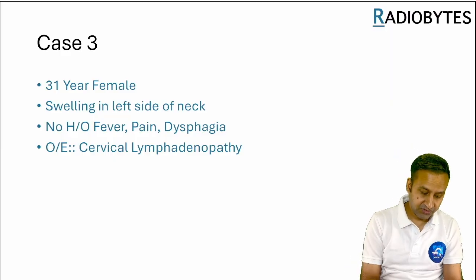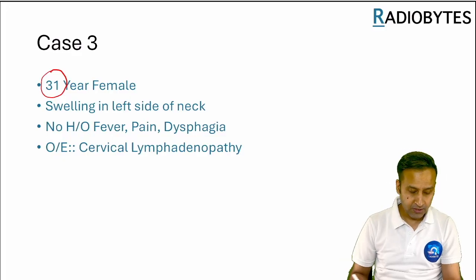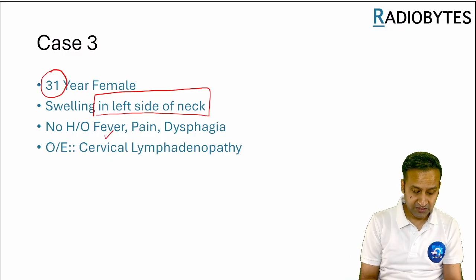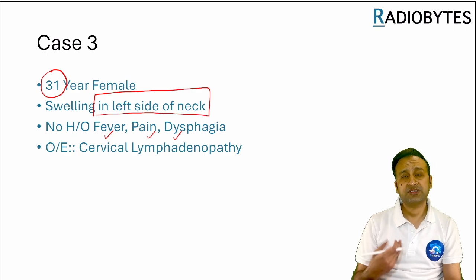Now, this case number 3, again, a young female, just a 31-year-old female, coming to us with swelling on the left side of the neck. And there's no history of constitutional symptoms like fever, pain, or dysphagia. And this swelling was present far laterally.